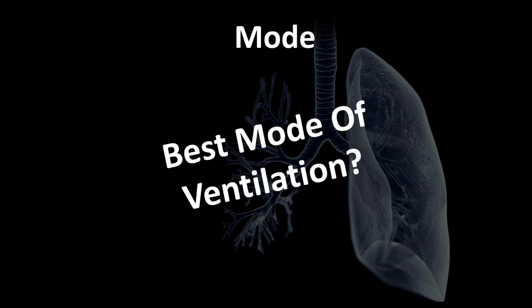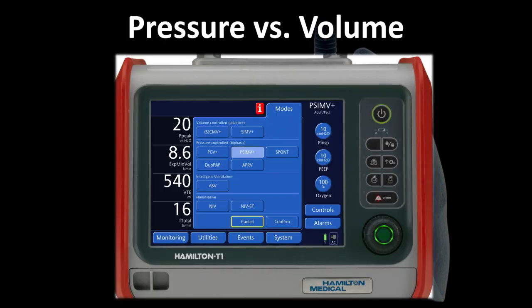What's the best mode of ventilation? Is there a best mode? Is there a best way we deliver a breath? An example here is the Hamilton T1. Is the Hamilton able to give a volume breath? And the answer is no.